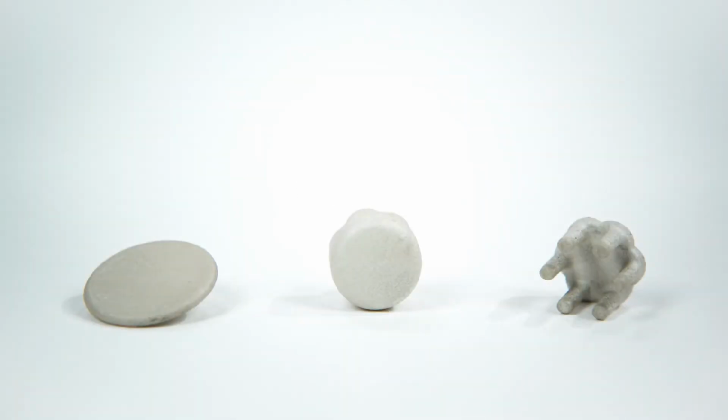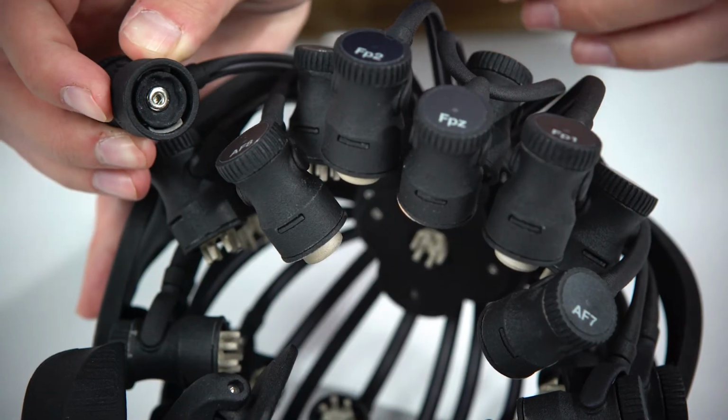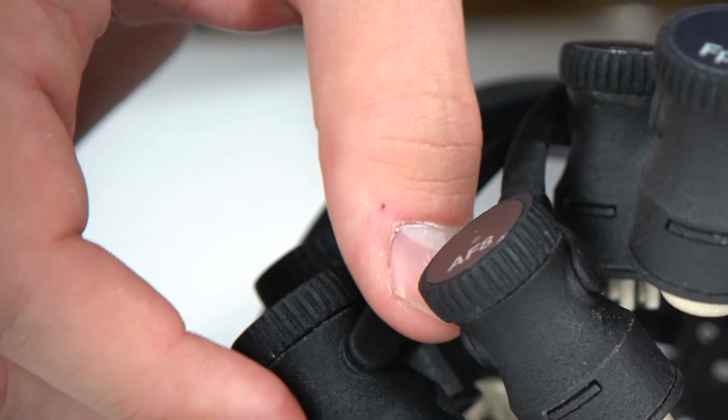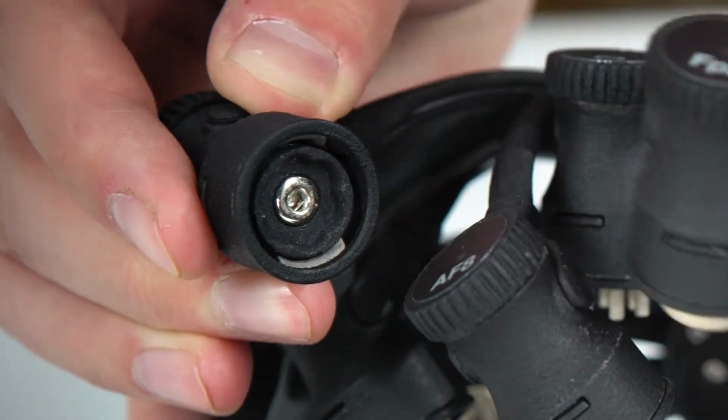Your system includes 3 sensors: DryPad ear sensors for the ear clips, and DryPad and Flex sensors for the head. Use DryPad sensors in positions where your subject has no hair, like the forehead and bald areas. Use Flex sensors to penetrate the hair. To install the sensors, push at the center. To remove, pry between the sensor and the connector. Do not pull on the tips of the sensor.